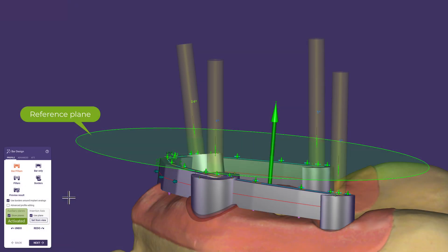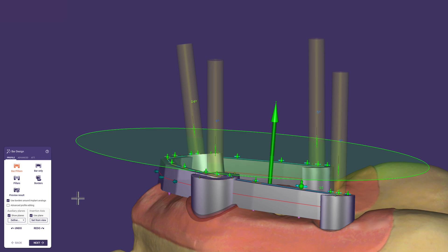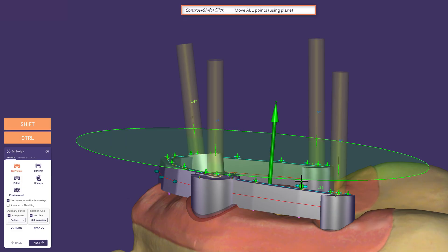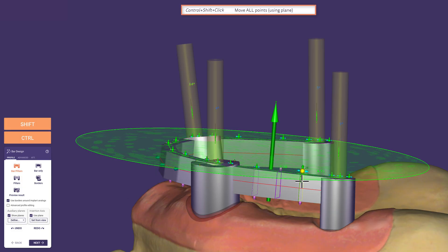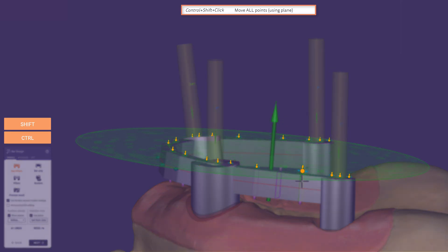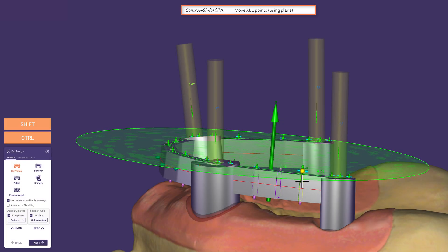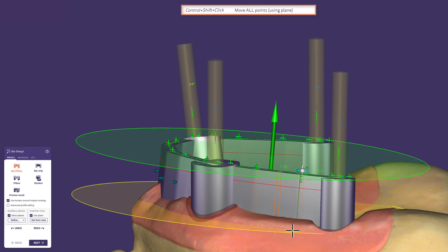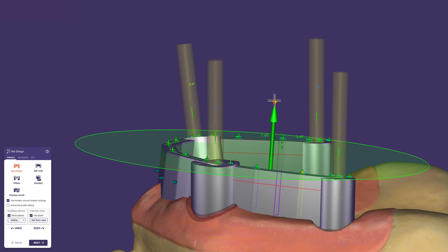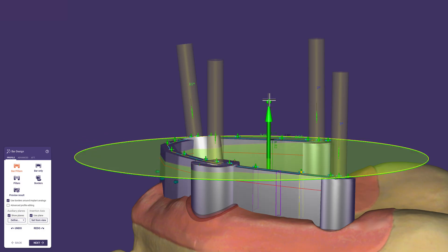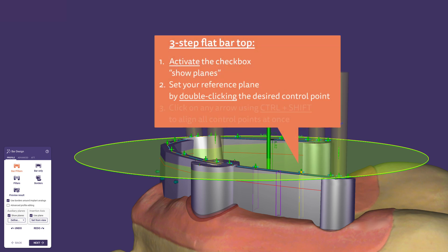Level the bar top with ease. If you want a flat bar top orthogonal to the insertion axis, the fastest way is to click on one of the upward arrows on the bar top while holding CTRL+SHIFT to align all control points at once to the reference plane — immediately the bar is leveled neatly. CTRL+SHIFT also works on the bar bottom, and you can angle the insertion axis independently from the parallel bar top. For most users this is the ideal workflow to get a parallel bar design with minimal effort.